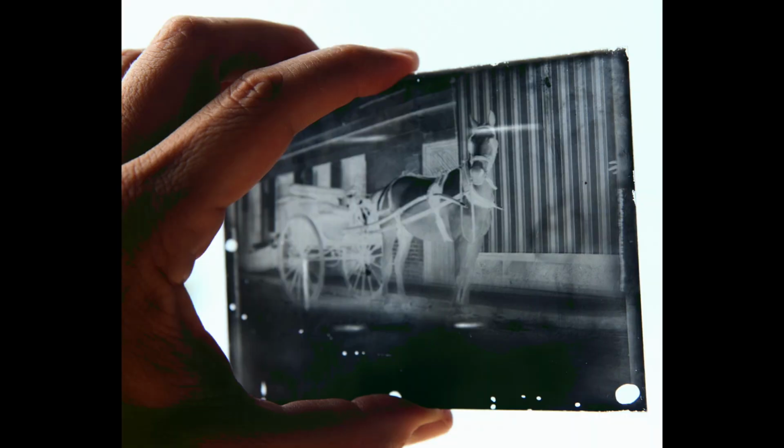Back in 1895, it was common for scientists such as Röntgen to have photography supplies lying around their labs because they sometimes wanted to document their experiments and findings. So film wasn't around yet, so what was used to make photographs then were these thin glass plates that were coated in silver salts.